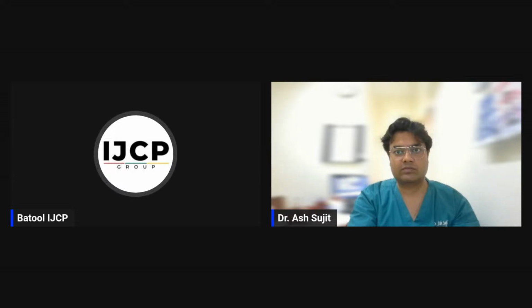With Sir's wonderful insights and experience, we are going to talk about the topic for today, which is USG interpretation: the role of USG in pelvic pain and masses like ovarian cysts, uterine fibroids, endometriosis. Before moving on to today's session, let us have a brief look at what the topic says.